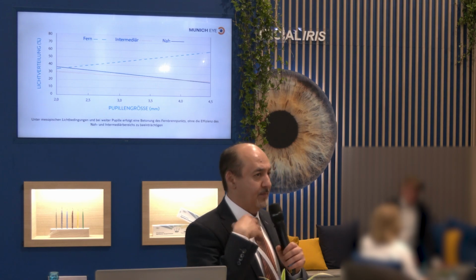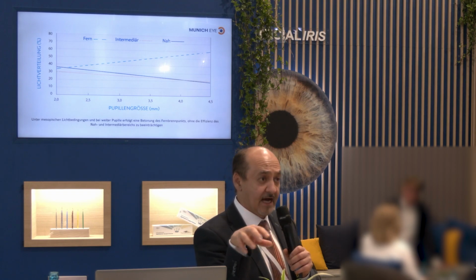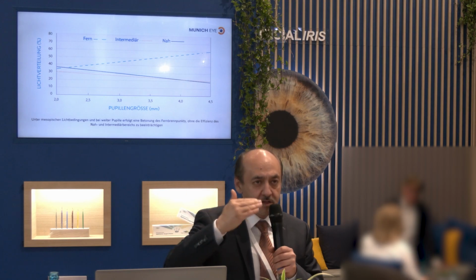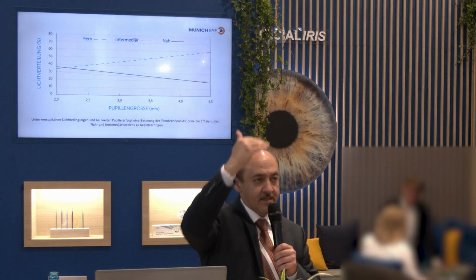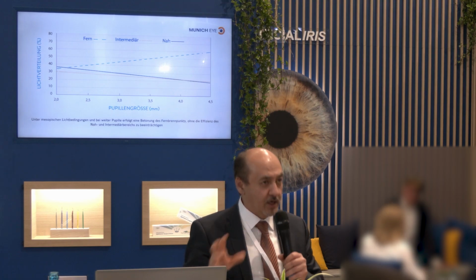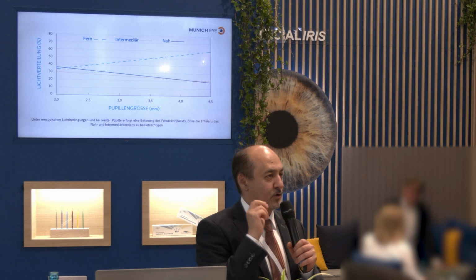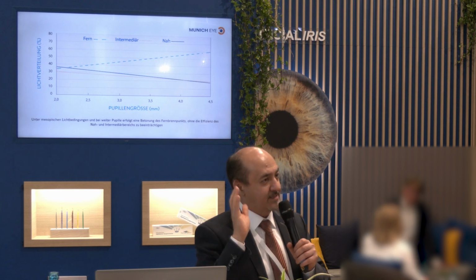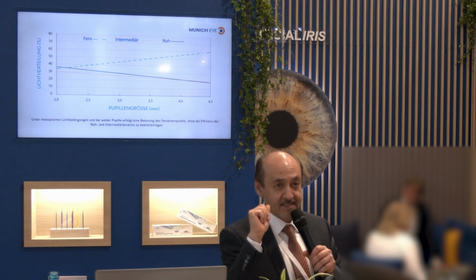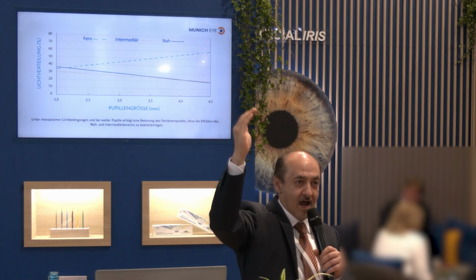My patients are more in the refractive area, i.e. clear lens exchange, than cataracts. That's why my patients don't come naturally from the MTF of 20% and look forward to 40. Cataract patients can be made happy with any still modest lens because they themselves have doubled the light efficiency and contrast with 40% light efficiency. The brain says, yay! If you do the same with a refractive clear lens exchange patient, he vomits in your beam because he had 100% before and you brought it to 40%.